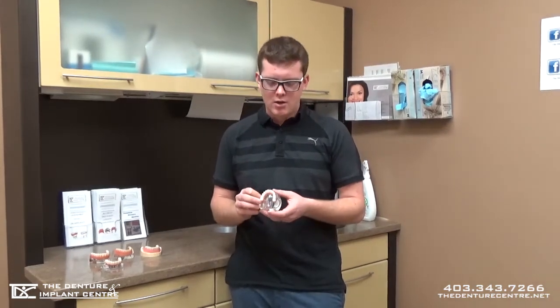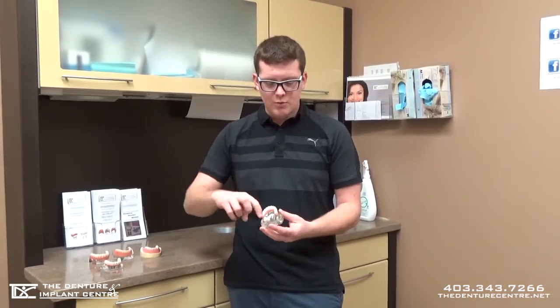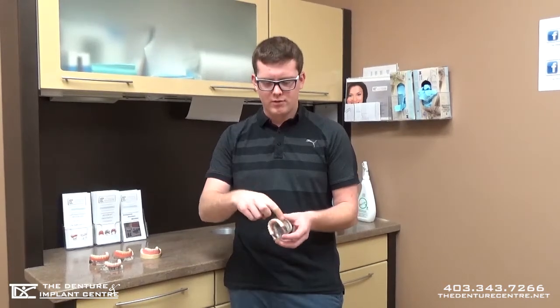The next step above a bar over denture is what we call a fixed non-removable denture. Basically this denture screws right into the implants and doesn't come out. I can take it out as a practitioner but you as a patient can't remove it. Because you can't remove it, there's no roof of the mouth, nothing along the sides — it's essentially a bead of teeth just like your natural teeth.